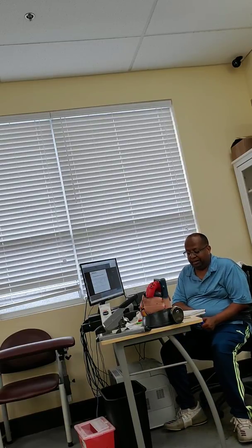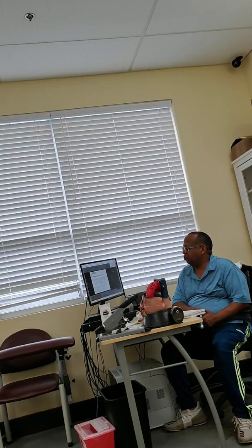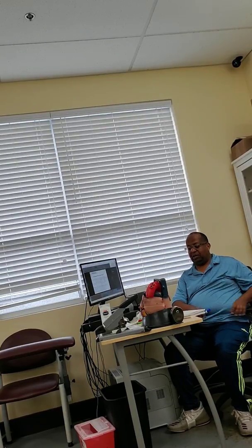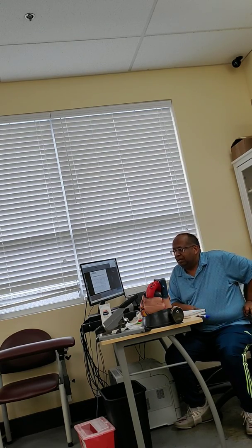Then the rate. Once you determine the rhythm, you go to the rate. We have two kinds of rates, ventricular and atrial, the same as the rhythms.